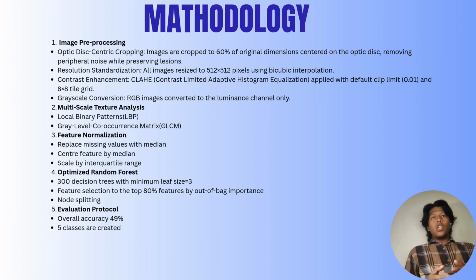And next is multi-scale texture analysis. We will use LBP and GLCM. For the third methodology, we will use feature normalization. We will replace the missing values with the median and center features by the median. We will scale by interquartile range.